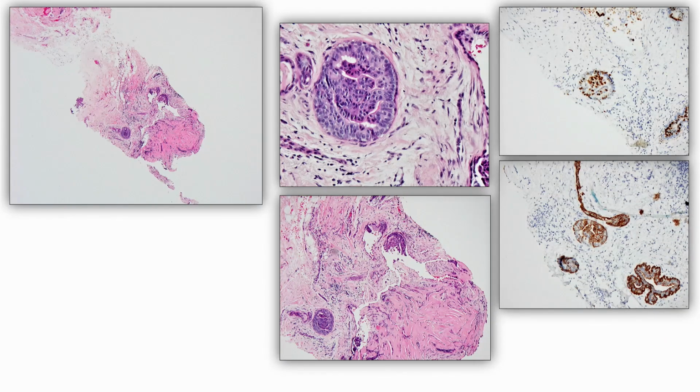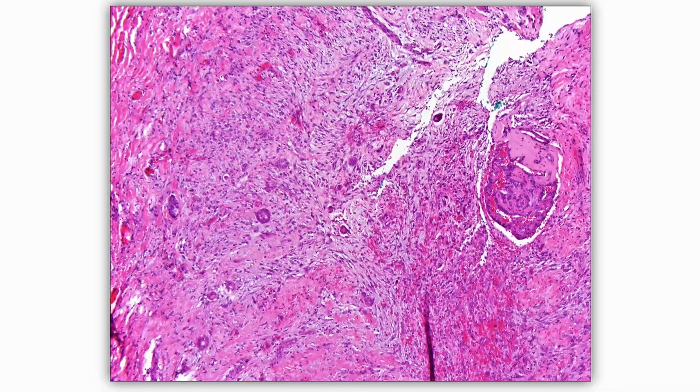This institution routinely did immunostains for things like this. So here's the ER and CK5/6. And you can see that it has a heterogeneous pattern of expression, so really should be called usual ductal hyperplasia. It was called atypical. I think the patient underwent excision, which may have been fine. It was a sclerosing lesion. There was some discordance. And so here is the sclerosing lesion.